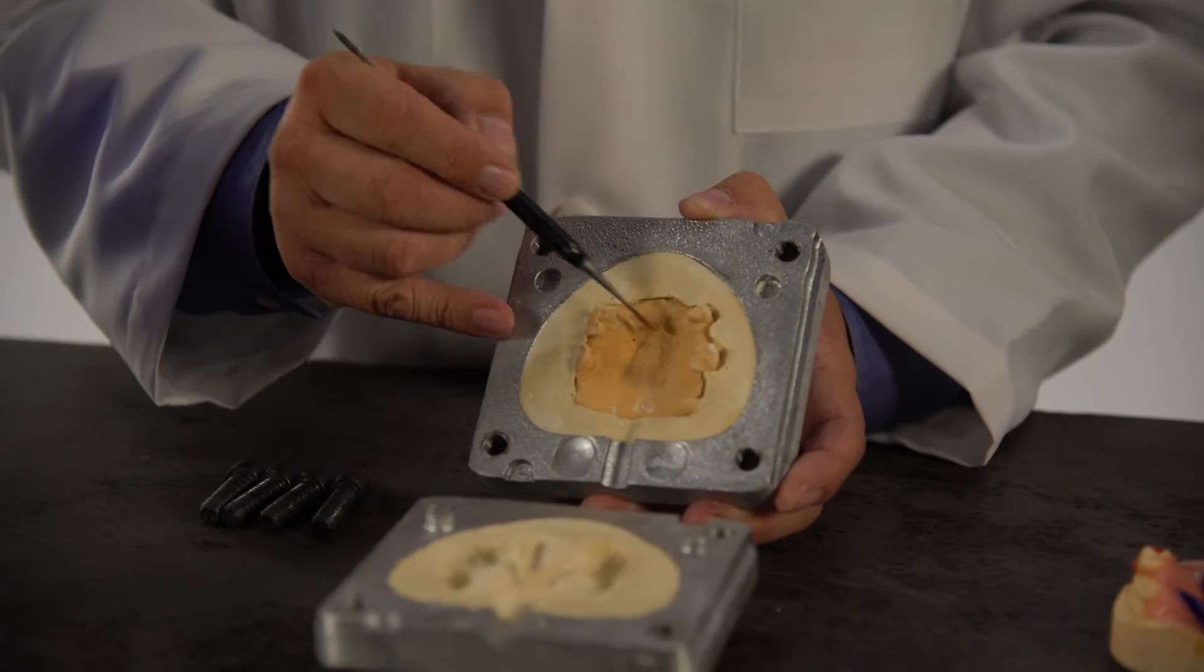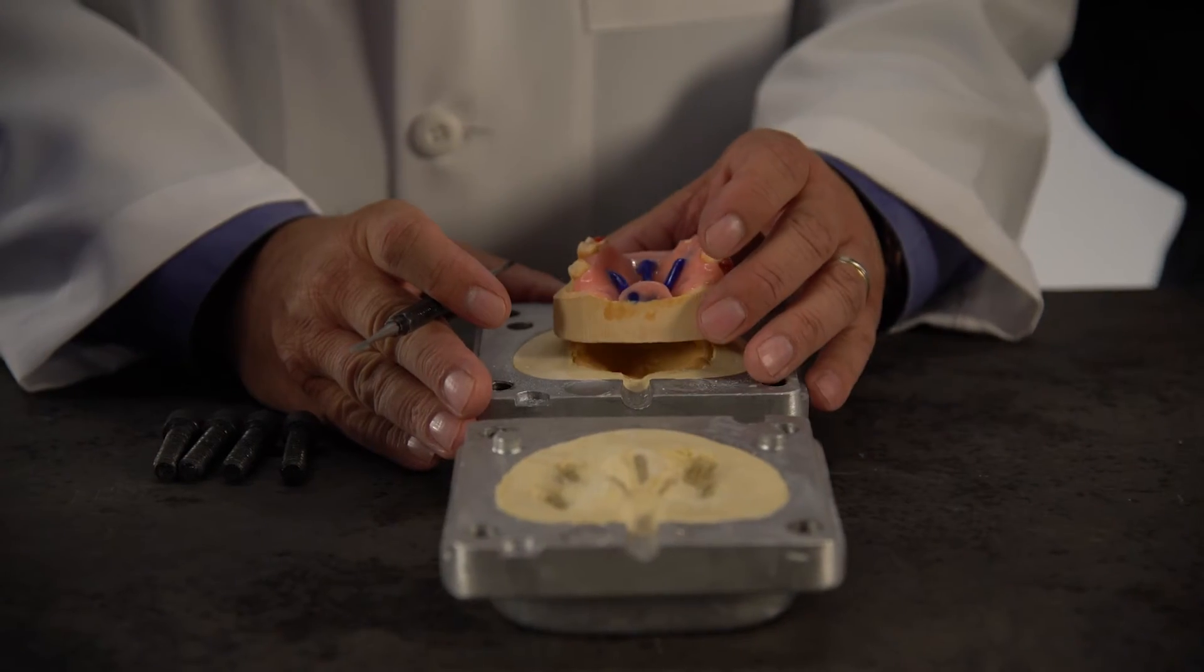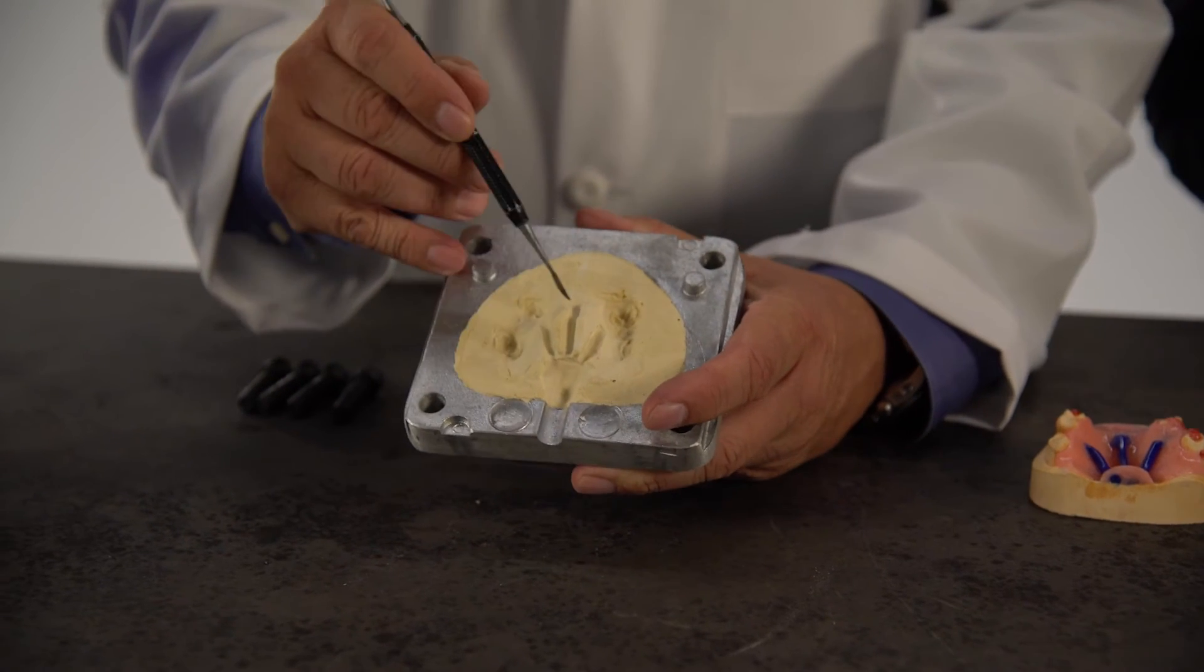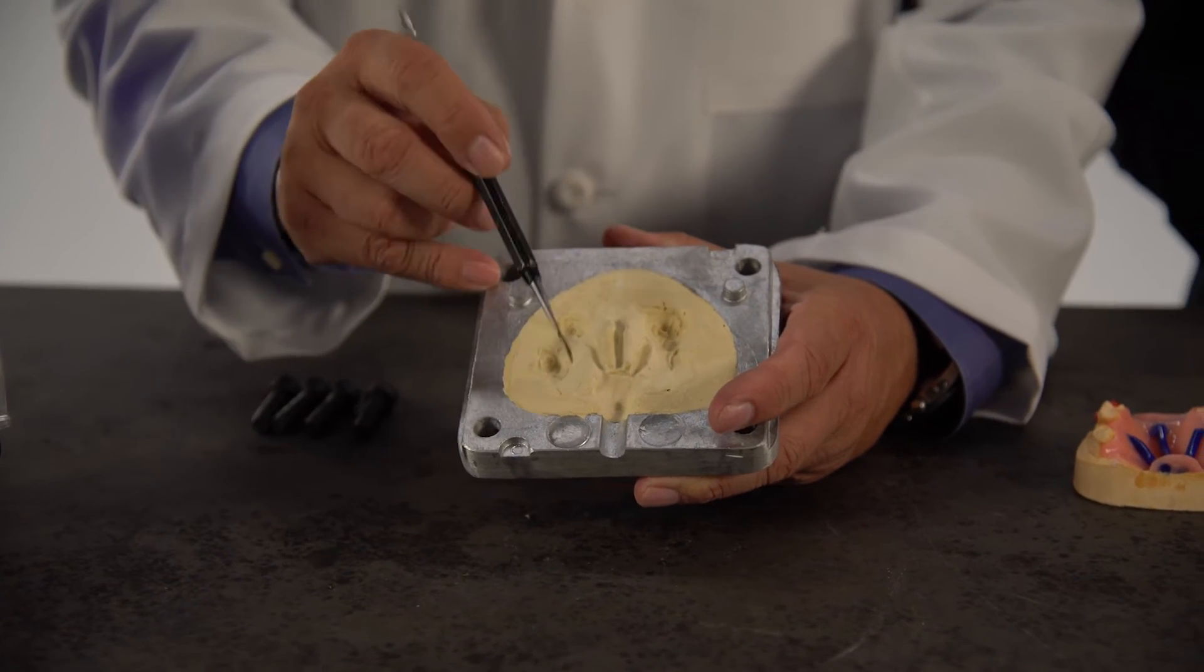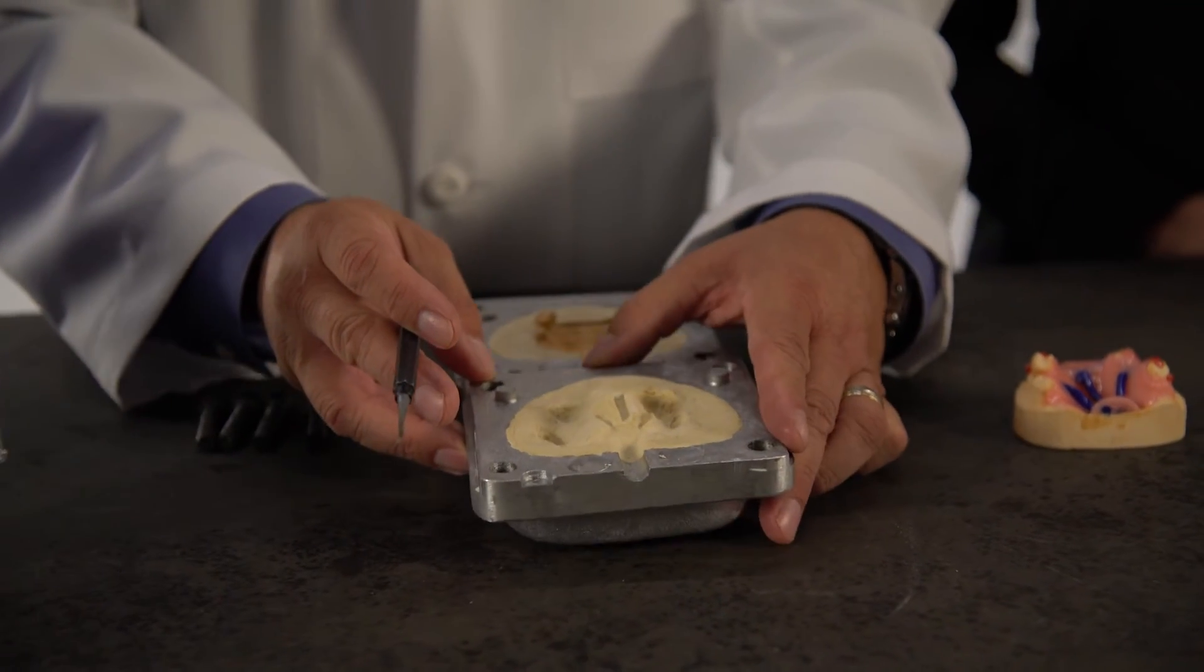You don't need any special gypsum to process clear mat. Apply sprues to the framework and invest model and wax up in the bottom half of the injection flask using type III stone. Usually three sprues are recommended. Add a channel excess sprue in the slotted section of the flask.